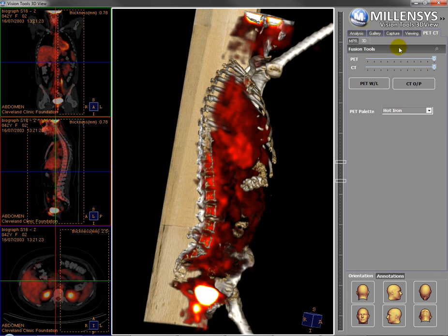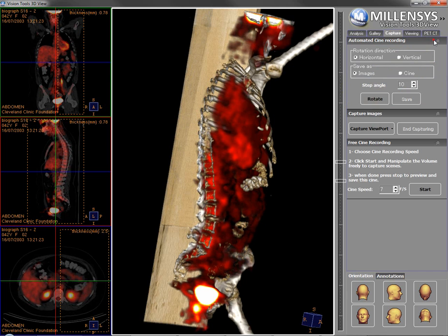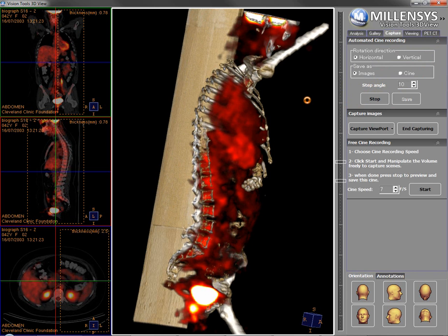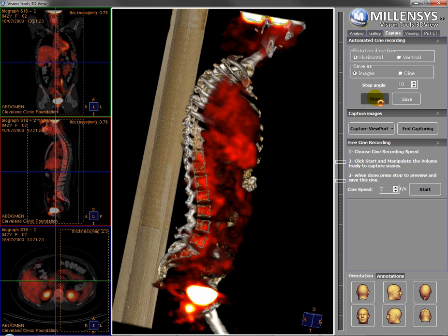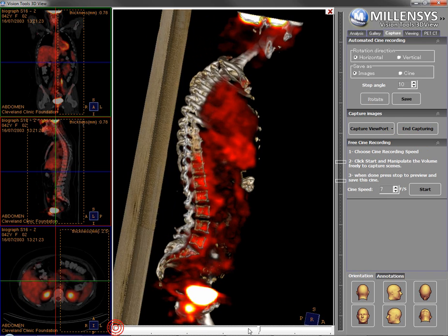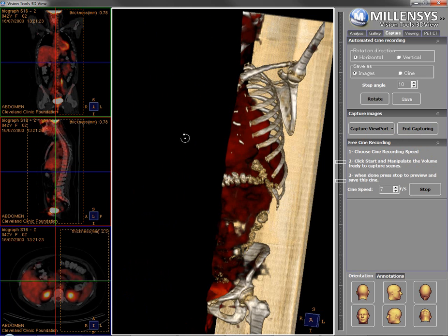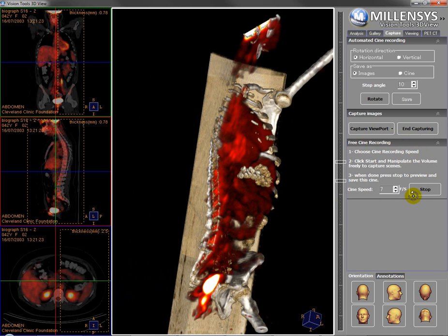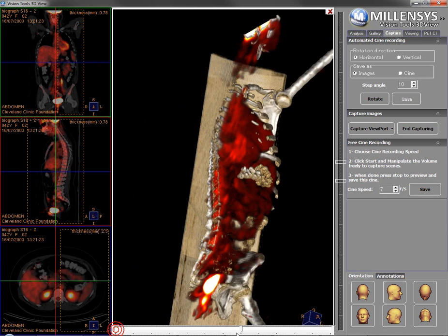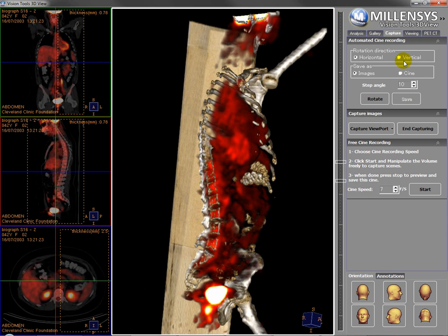We can also use the standard capturing tools of the 3D — I can rotate the volume like this and capture a rotating image, or I can move freely using the free cine recording tool. Thank you.